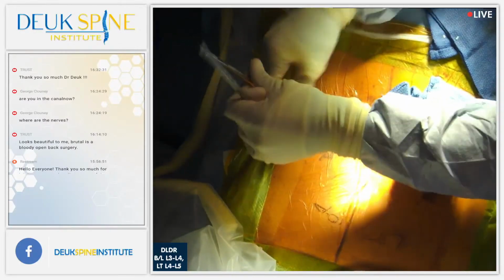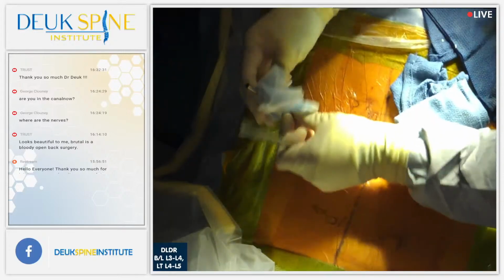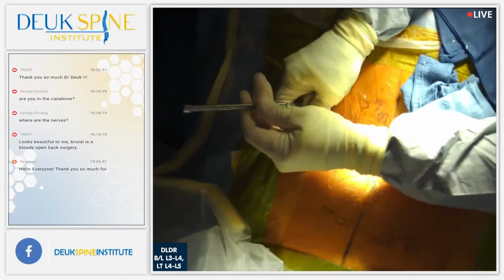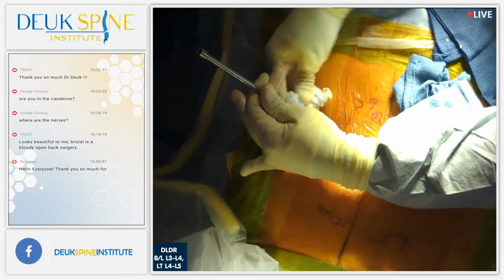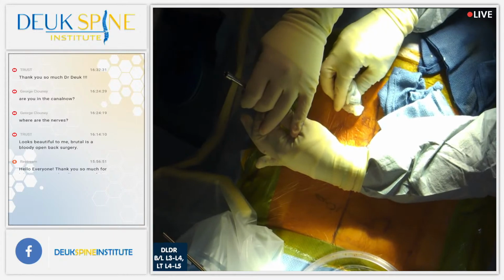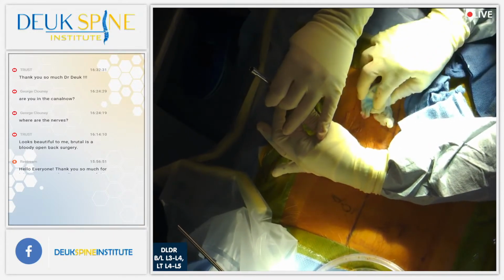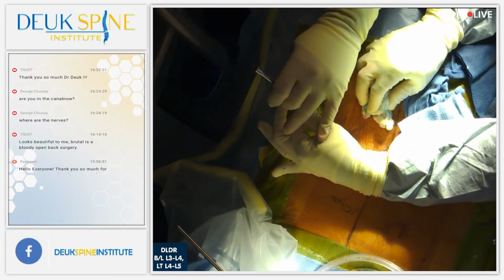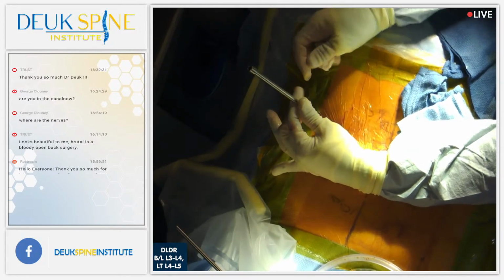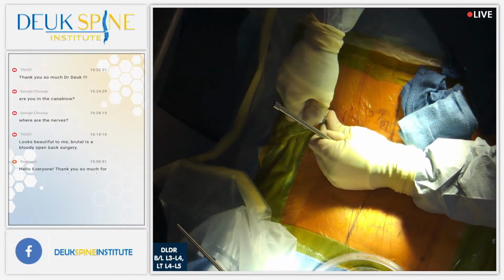The bouncing is because you're hitting the herniation. It's so rubbery with all the scar tissue, and it's bouncing you back. I can feel it. So I'm literally pushing the herniation back in. And then I take the herniation pieces out from inside. Shot? All right, that's good. Last one, 10 minutes left.